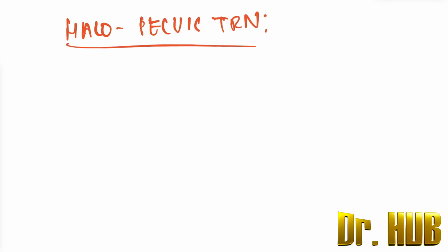Next we move on to the halopelvic traction. For halopelvic traction, the type is a skeletal traction, and the use is for scoliosis.